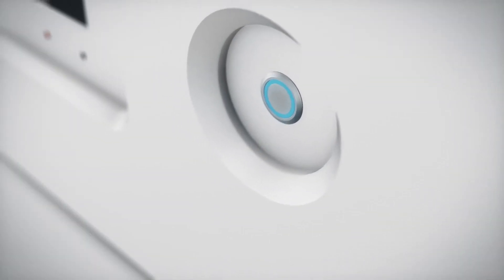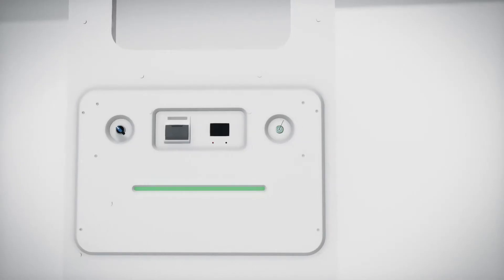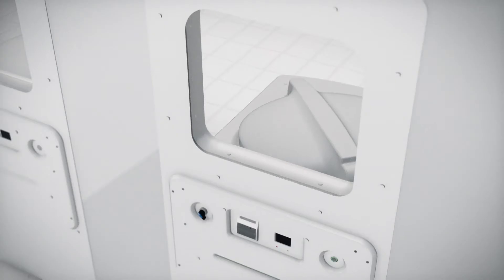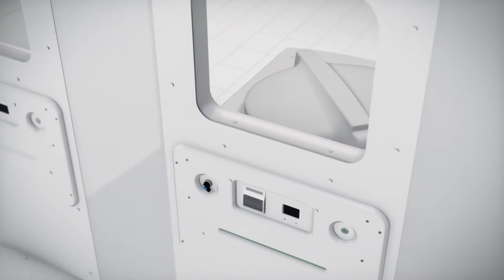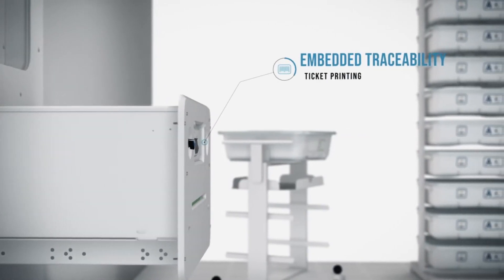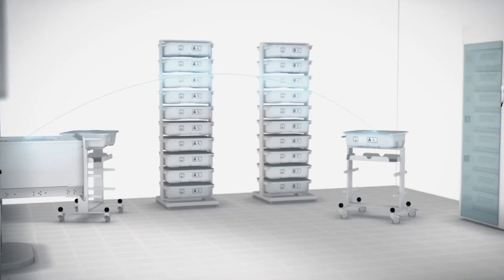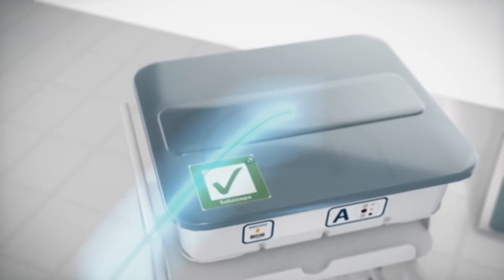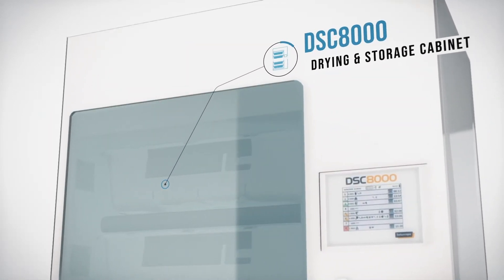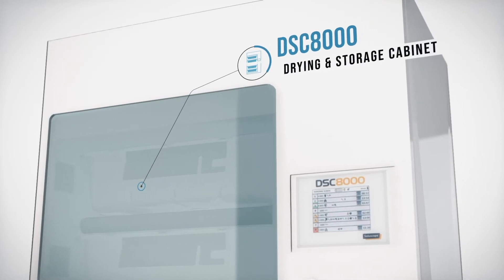From the clean room, the intuitive interface keeps you constantly updated on the progress of the cycle, and the window makes it easy to communicate between two rooms. The automatic drawer then allows you to recover the endoscopes with their connectors, place them in the tray, and transfer directly into the DSC-8000 drying and storage cabinet with minimum contact.